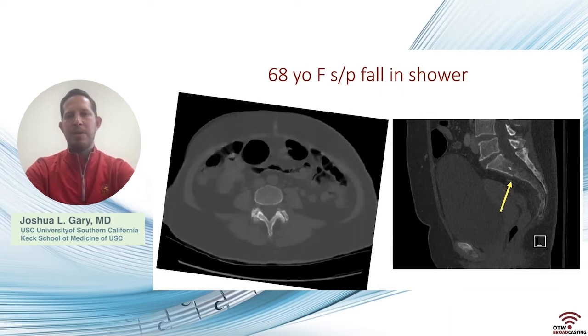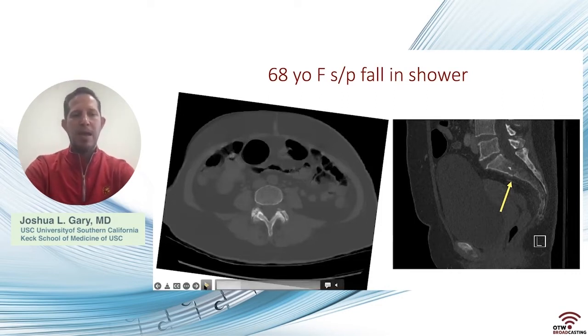And like we talked about earlier with the bowel and bladder, if you look, you can see her bladder in the soft tissue shadow, and it's very full. So it's something we commonly see in these patients with pain. And I think it's really an indication of what's going on, and surgery can help them with stabilization. So we've identified here a Y-shaped pattern. She's got a U-shaped pattern in the back and then extension into the left hemipelvis.